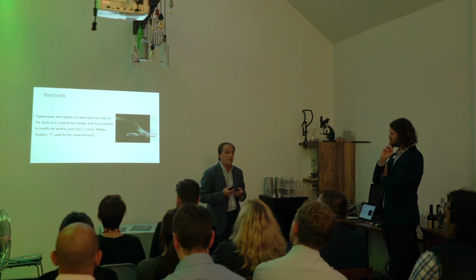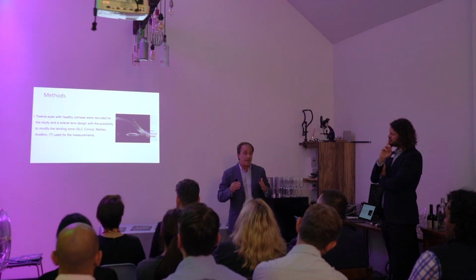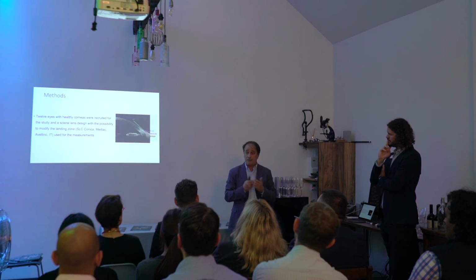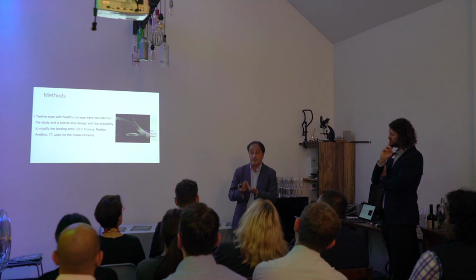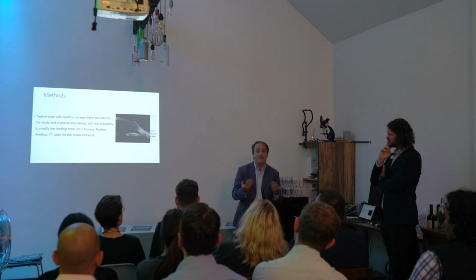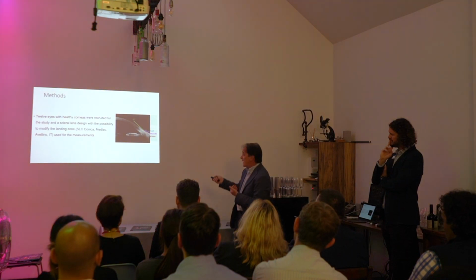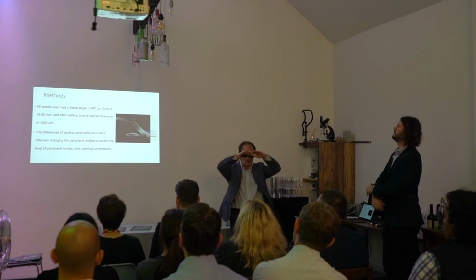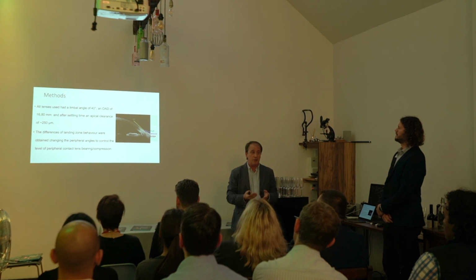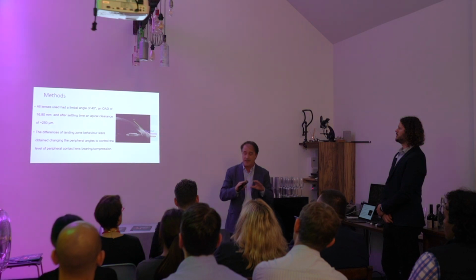And so to do this, we use scleral lenses, an Italian design, and this kind of scleral lens has the possibility to change the periphery, because our idea is to modify it, to introduce something wrong during fitting, to evaluate what happens, because the normal thing is easy, but not useful for us to understand what happens. And this was the idea. And we use the same angle about the vault. We consider a normal cornea, not an irregular cornea, because it was just to understand the peripheral behavior.